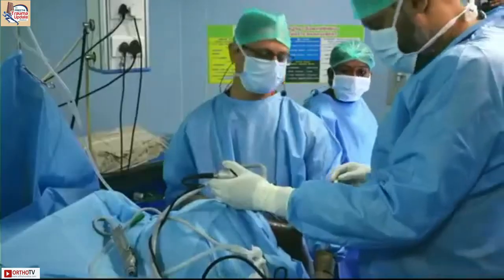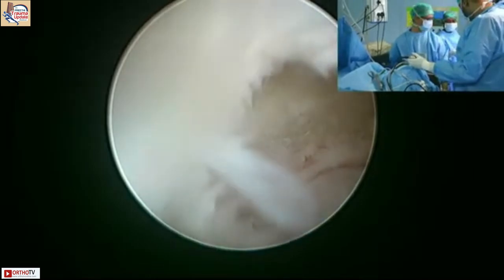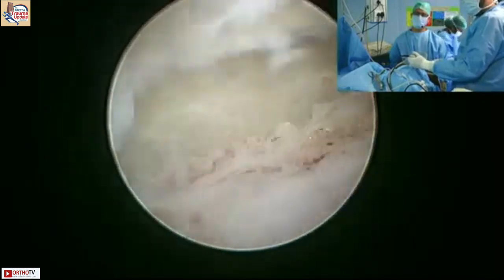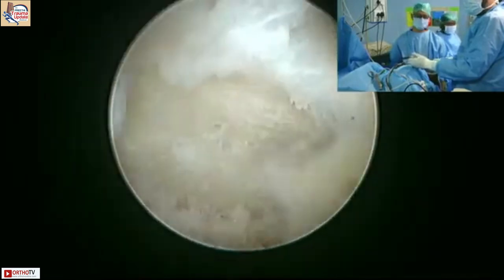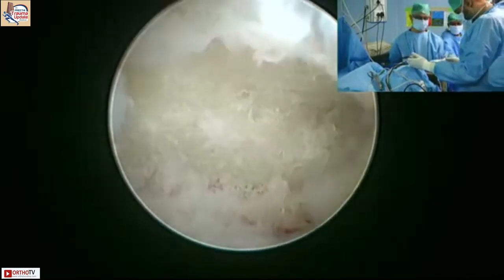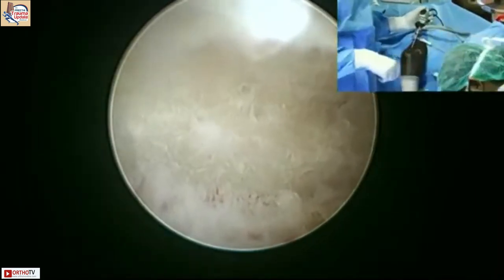Needle, please. So we're in the posterior portal now. And then, all right, that's it. Okay, can you see the needle coming in? So this is posteromedial. Yeah, so the scope is trans triceps. Okay. And then you have a posterolateral. You don't want to go posteromedial because you have the nerve there, right? And the elbow is swollen, so you really don't know where the nerve is right now.